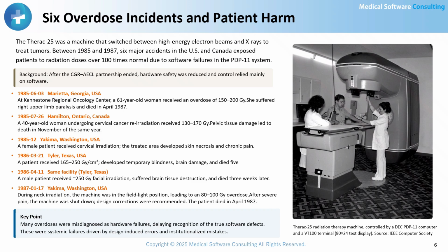Findings at the University of Chicago: Dr. Frank Bova examined the older Therac 20 and observed that fast typing or corrections often caused shutdowns by blowing fuses. On the Therac 20, these failures protected patients. On the Therac 25 without hardware safeguards, the same flaws translated into lethal overdoses. This showed the core problem was not operator error, but unsafe design.